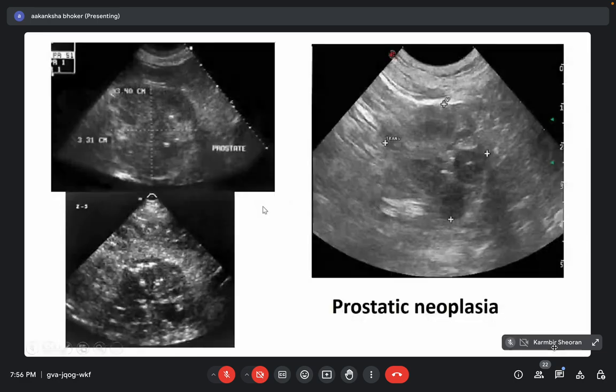Next, after prostatitis, BPH and prostatic cyst, these cysts can be abscesses. The same rule will apply every time. Just to get a first-hand image, a cyst will have clear anechoic content with a sharp margin, whereas in an abscess there will be a little more echogenicity, because an abscess is more viscous compared to the exudate of the cyst. However, confirmation can only be achieved by getting a biopsy done.